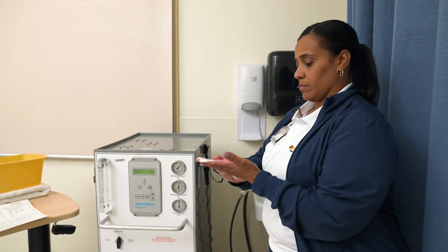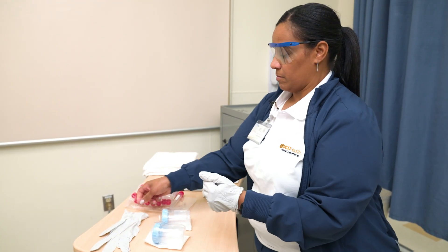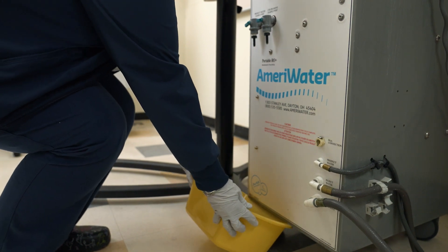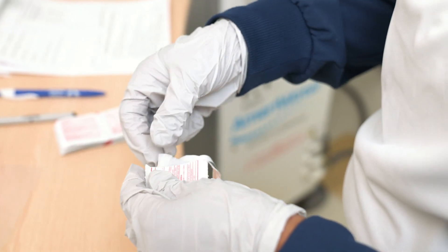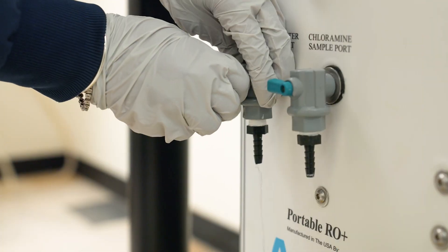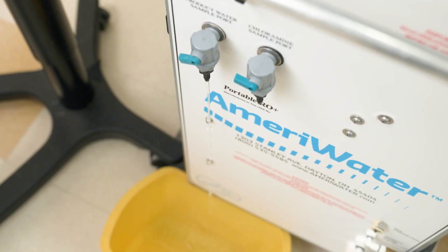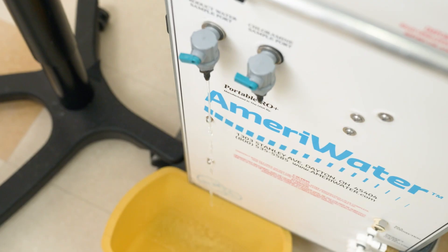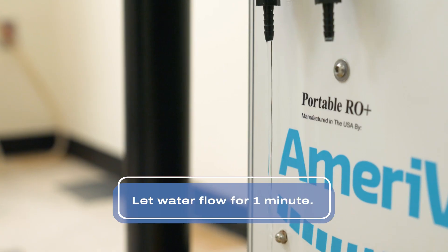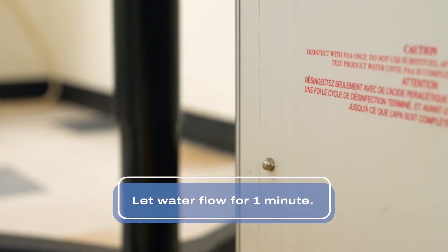First, begin with hand hygiene, then don goggles and gloves. Place a bucket under the product water sample port. Using an alcohol wipe, wipe the tip of the product water sample port for 5 seconds. Let it air dry, then turn on the port, letting the water flow into the bucket. Always follow the manufacturer's instructions for disinfecting the sample port. Before collecting the sample for bacteria and microbiological and endotoxin tests, you must let the water flow for at least one minute.